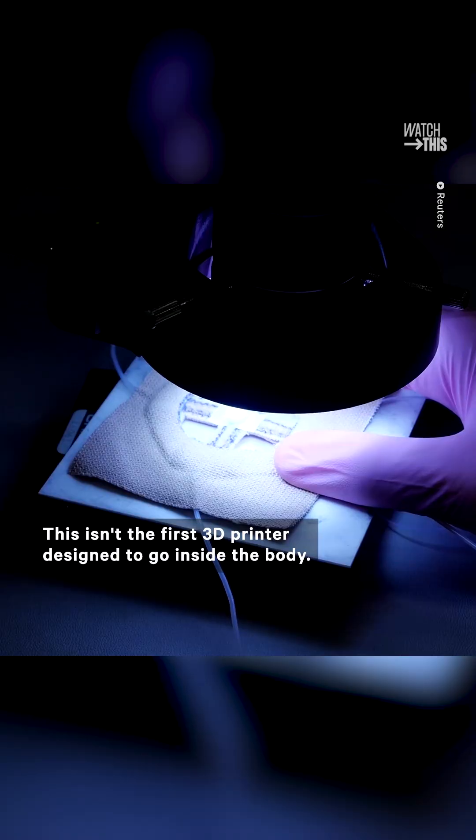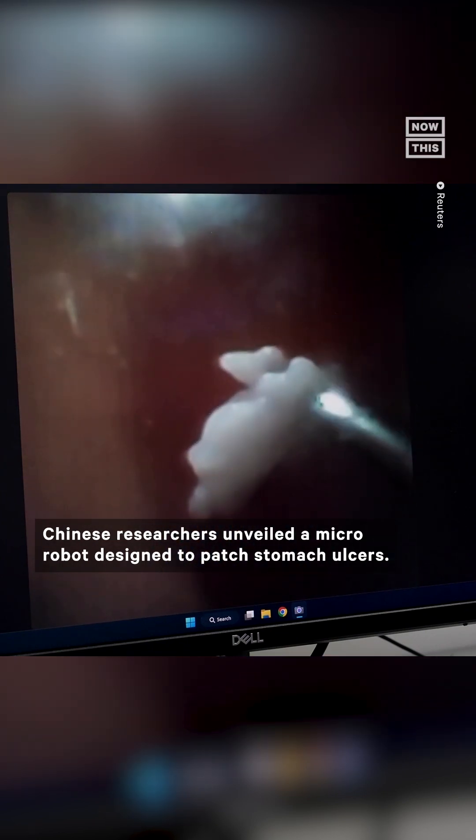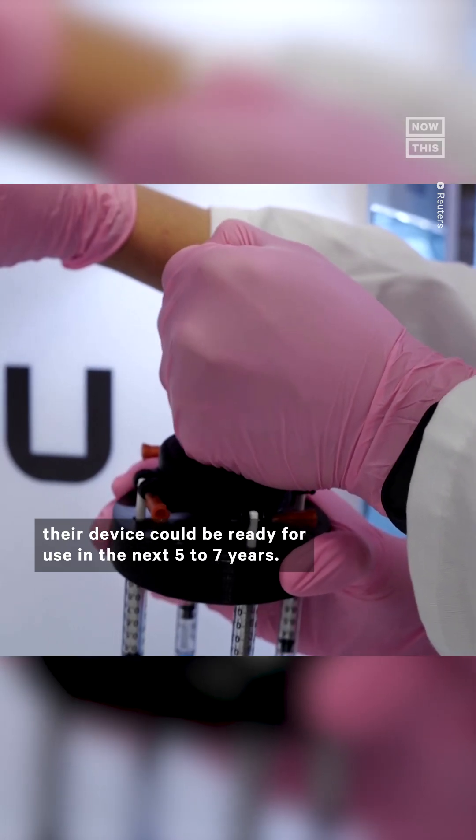This isn't the first 3D printer designed to go inside the body — in 2020, Chinese researchers unveiled a micro robot designed to patch stomach ulcers. The team in Australia said that if future clinical trials go well, their device could be ready for use in the next 5 to 7 years.